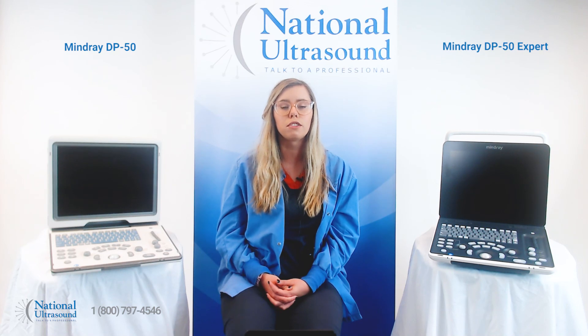The DP50 Expert includes all the original features and transducers from the popular DP50 machine as well. Check out our other video review on the DP50 Expert to find out more.